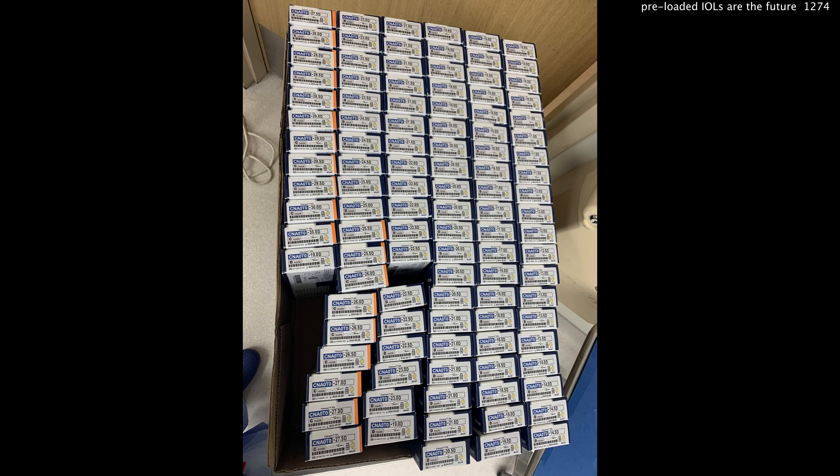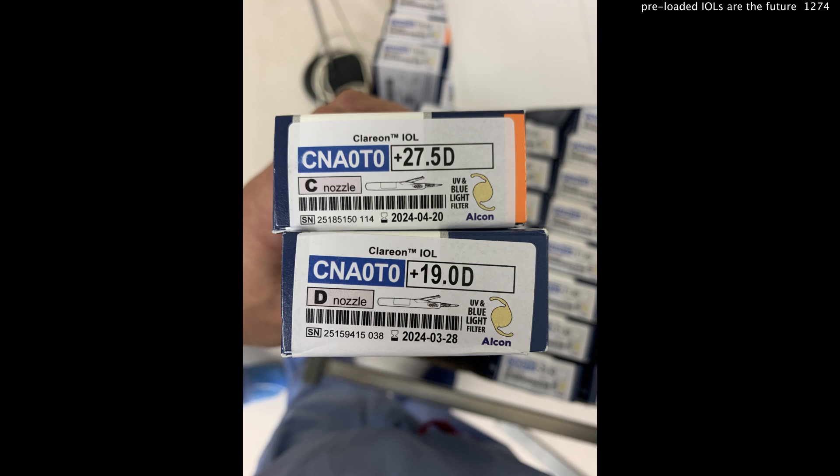Here you can see all the lenses. One thing to notice: the ones with a little orange stripe are the higher power lenses and have a bigger tip. It says C nozzle on the top because that's a 27.5 diopter lens, compared to the D nozzle on the bottom because that's a normal size lens.